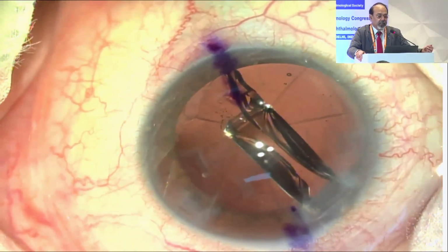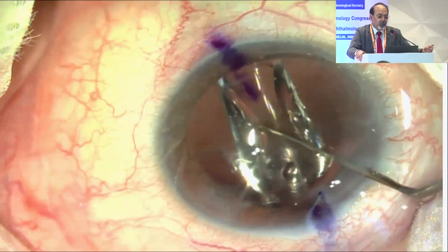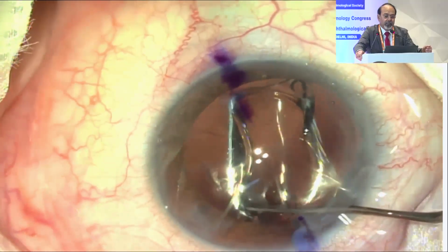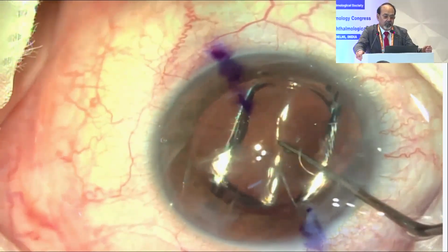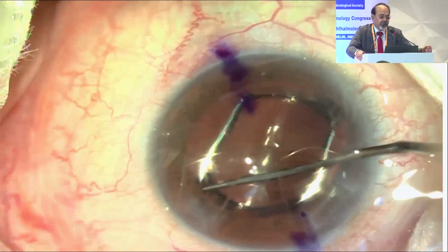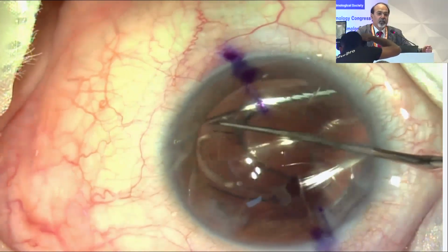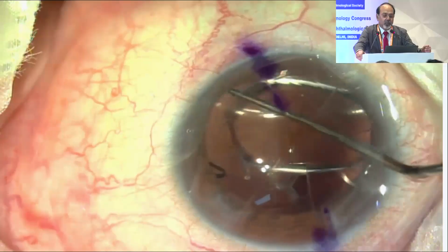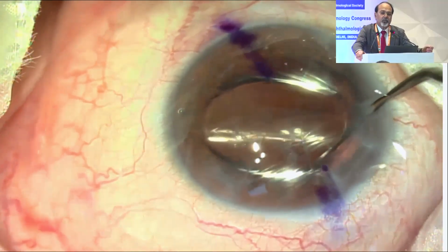And then you inject the IOL, and I would not prefer to inject it completely inside. I want to gradually insert it within the capsular bag and gently rotate it. And as you can see, despite the fact that there is so much manipulation of the lens, there is no problem in these cuts which are there on the cornea. There is no problem of opening them.